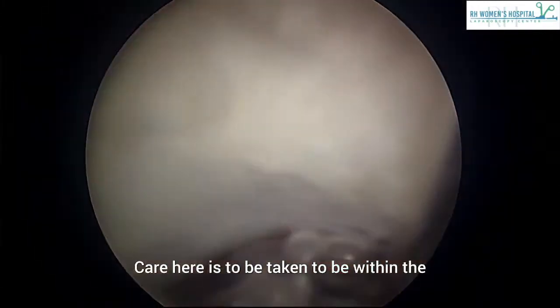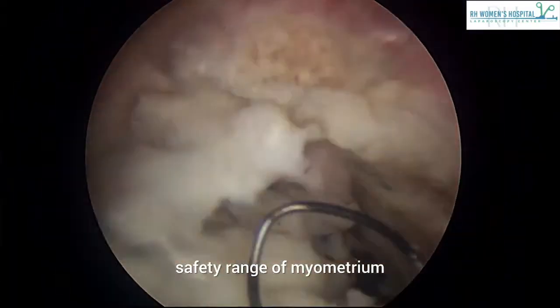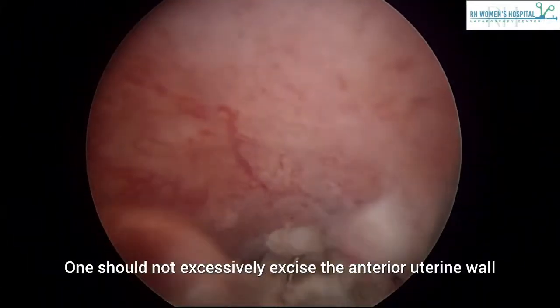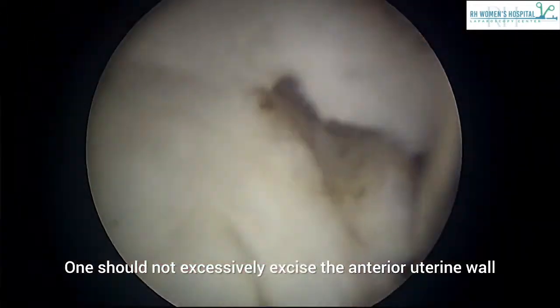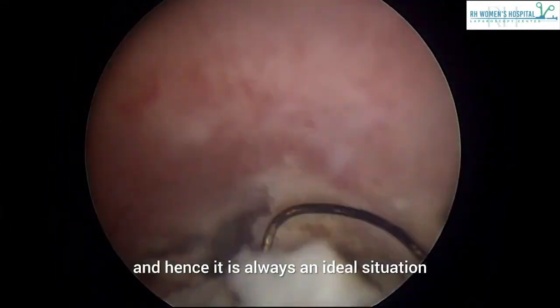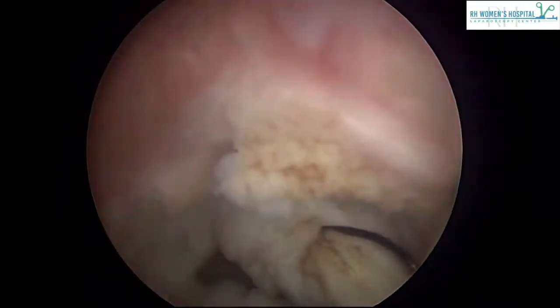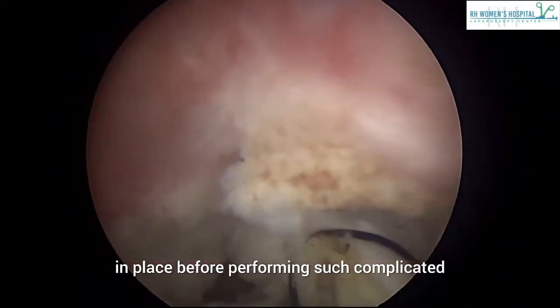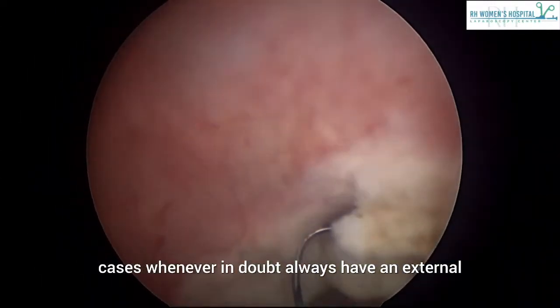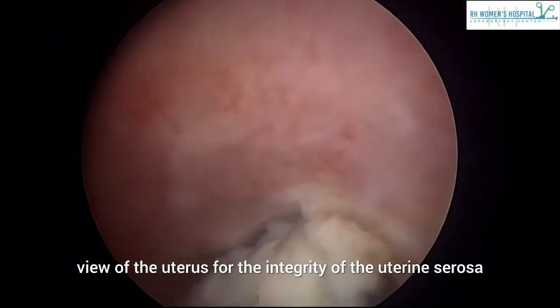Care here is to be taken to be within the safety range of myometrium. One should not excessively excise the anterior uterine wall, and hence it is always an ideal situation to have an intra-abdominal port in place before performing such complicated cases. Whenever in doubt, always have an external view of the uterus for the integrity of the uterine serosa.